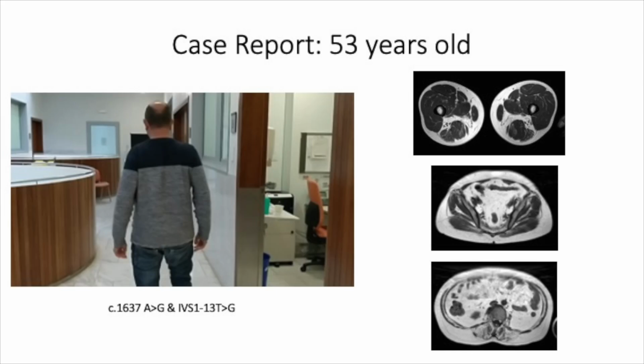So I would like you to press the video again. I have shown this video several times, so this patient is now familiar for some of you, but this is someone that said, I don't have any problem. I can do my life completely normal. I am pre-symptomatic, okay. And when we look at the muscle MRI, sorry, this is the muscle MRI of this patient. There was lots of fat. So this was a few years ago. Now this patient is treated and he uses a stick for walking.